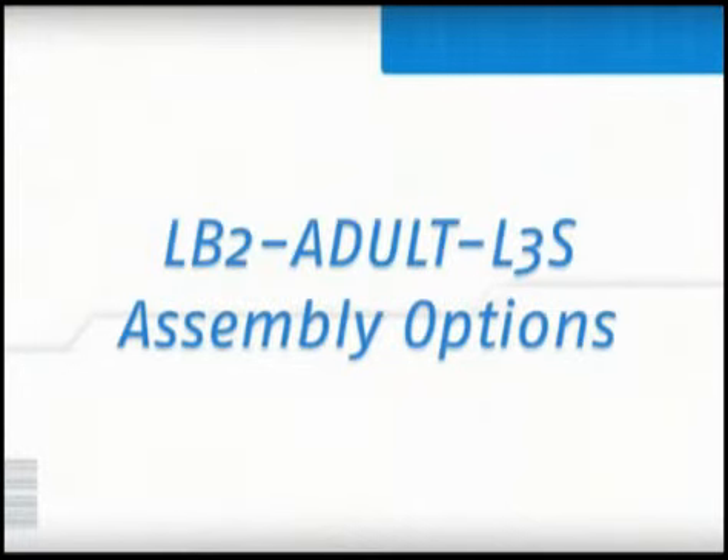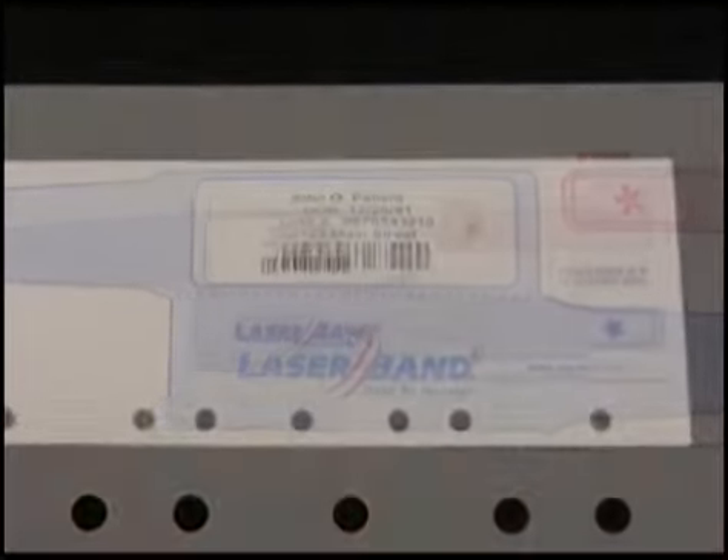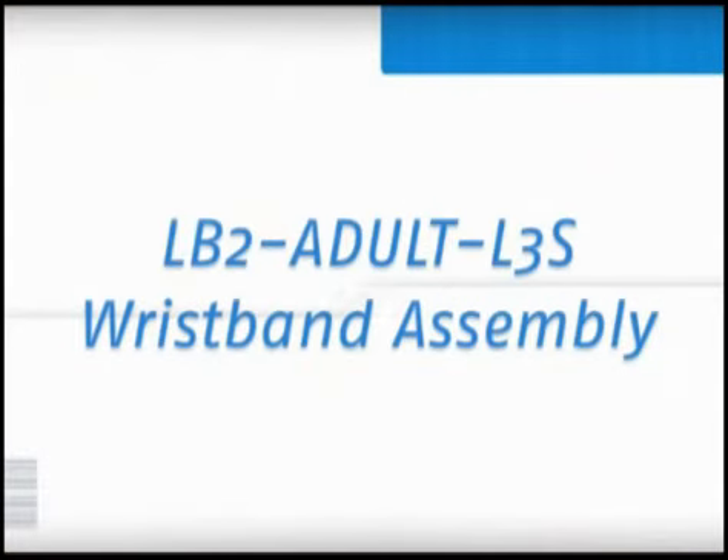There are two product assembly choices for the LB2 Adult L3S form, which include using the adult wristband alone or using it in conjunction with the wristband extender. First, we will begin by assembling the L3S wristband found on the middle of the carrier form.